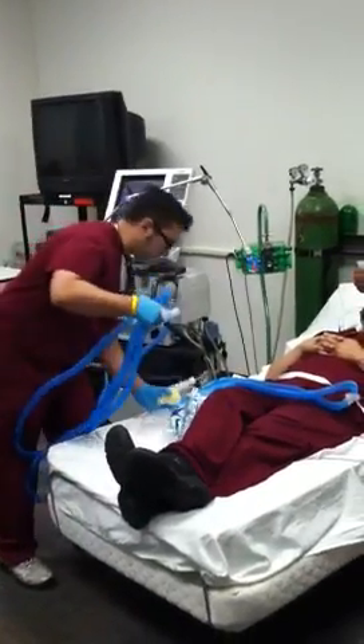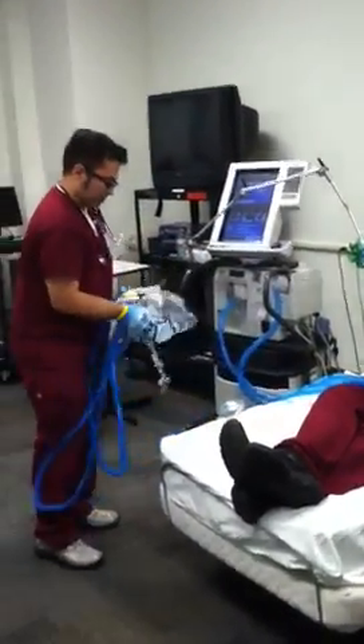Art is going to change out the circuit, disconnecting the used circuit and attaching the new one.